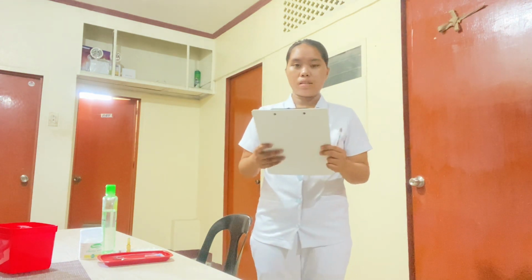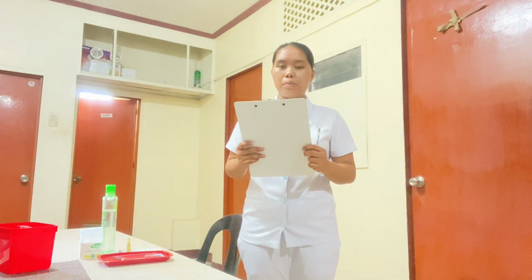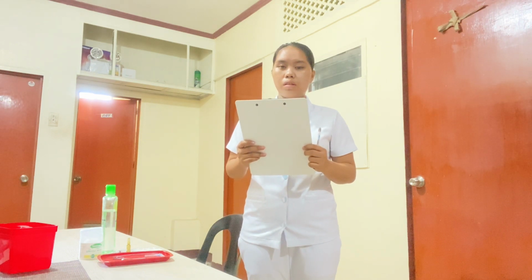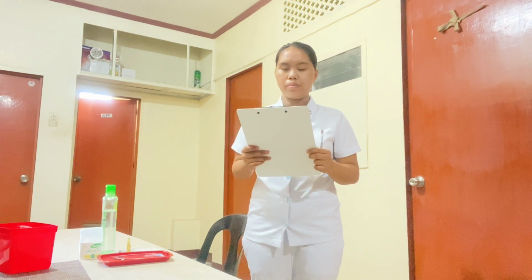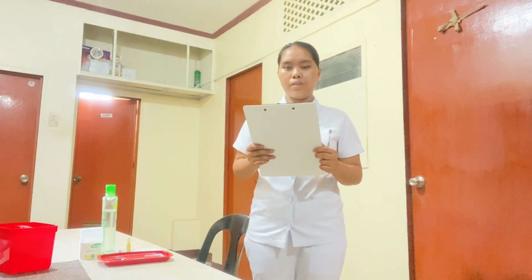Follow the 3 checks. First check is when it's taken to the medication cart. Second is before withdrawing the medication. Third is after withdrawing the medication. Lastly, organize the equipment to save time and energy.